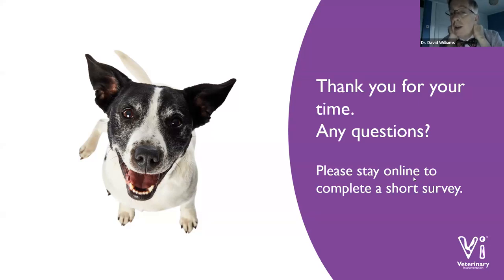Some people do. What I would use actually, if people from veterinary specialty products are watching this, I don't use dog contact lenses. I use human single-use contact lenses, and that's these. They could work well, but generally, I must admit, I don't do that.